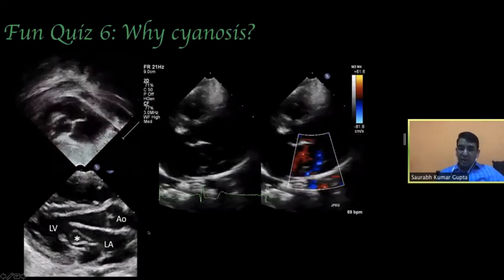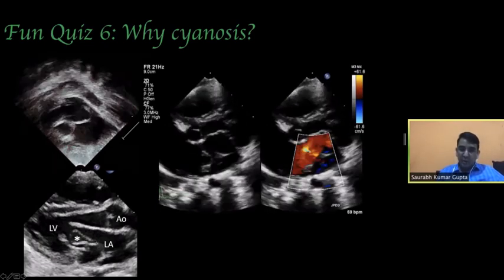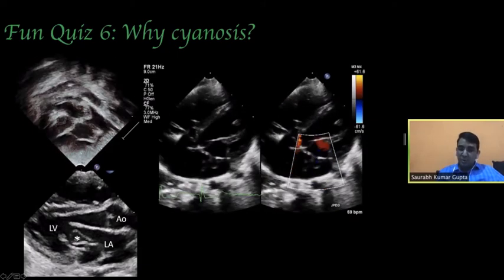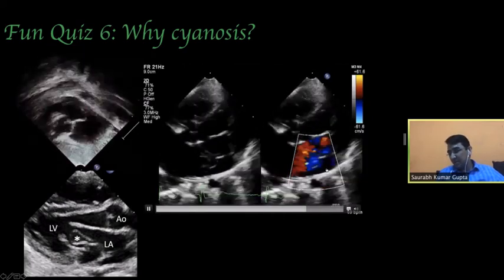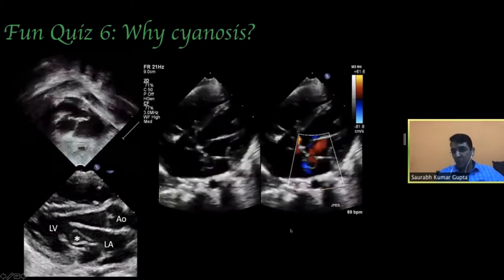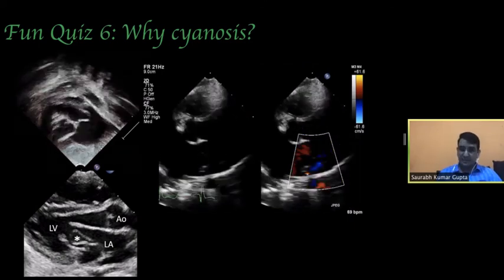And these were the echocardiograms. As you can see in this parasternal long axis view, this coronary sinus was quite redundant, and it was getting through the mitral valve into the left ventricle to some extent. And this was the color Doppler. As you can see over here, it seems all fine, the color flow in the coronary sinus is as good as you want. But then the question was, what is the cause of cyanosis?